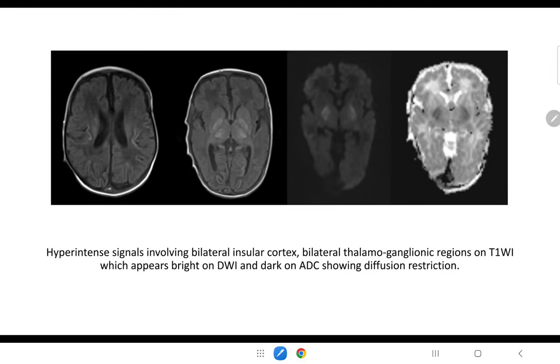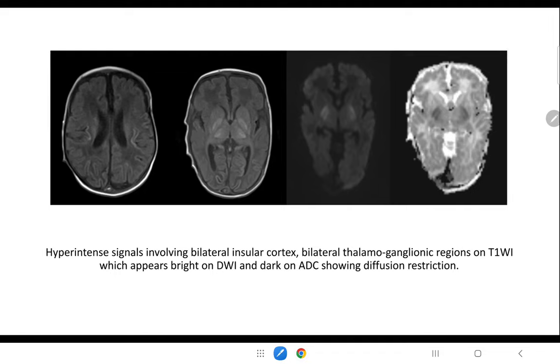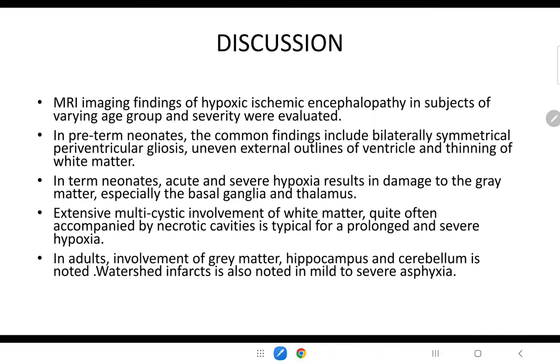FLAIR at the level of ventricles and the capsulolenticular region and diffusion-weighted imaging at the level of the capsuloganglionic region with corresponding ADC maps show hyperintense signals involving bilateral insular cortex and bilateral thalamoganglionic regions, which appear bright on DWI and dark on ADC, indicating diffusion restriction.